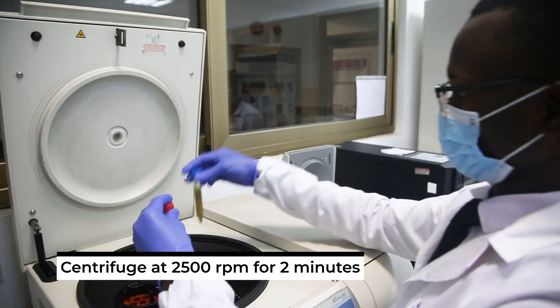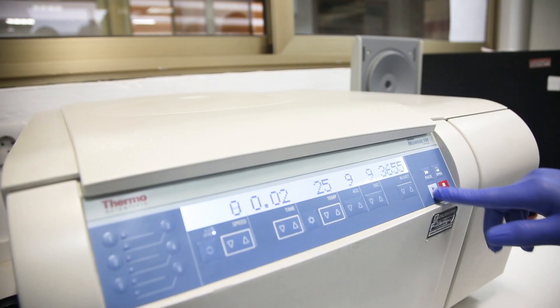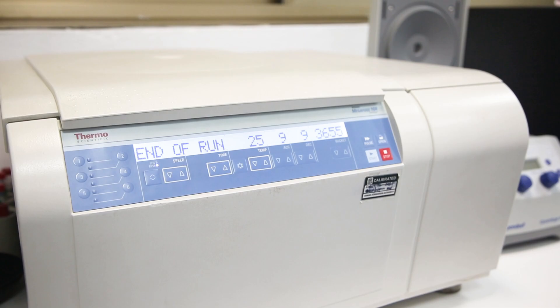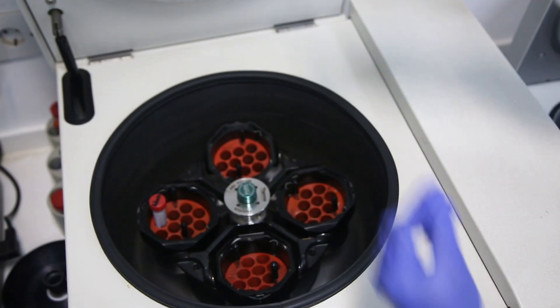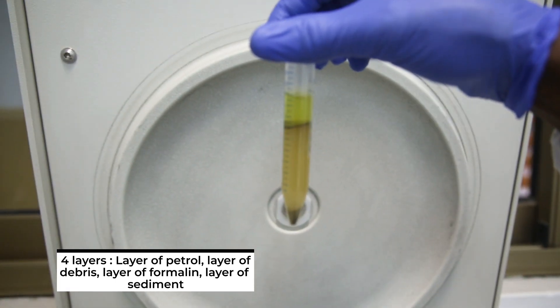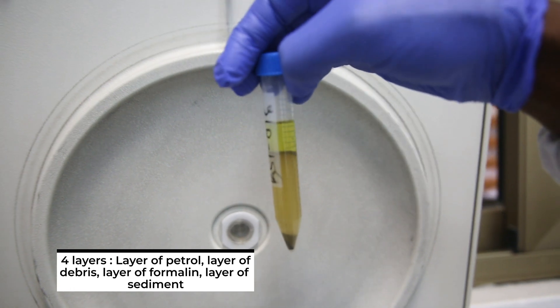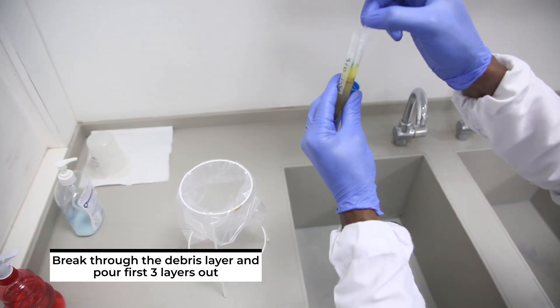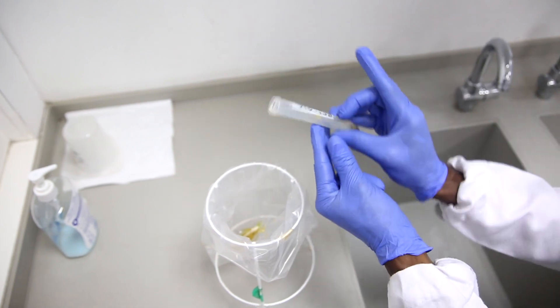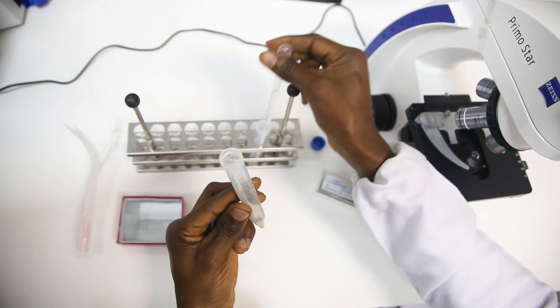Then you centrifuge at 2500 rpm for two minutes. You are going to see four layers: the layer of ether or petrol, the layer of debris, the layer of formalin, and last, the layer of sediment. You break through the debris layer and pour the first three layers out.